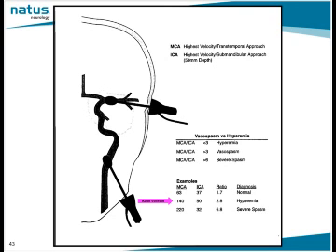This patient has an MCA of 140, the extracranial ICA of 50, and they have a ratio then, that MCA divided by that extracranial ICA, of 2.8. This tells our interpreting physicians that flow is high globally. It's high in the neck. It's also high in the brain. That is the hyperemia because that ratio is less than 3.0.